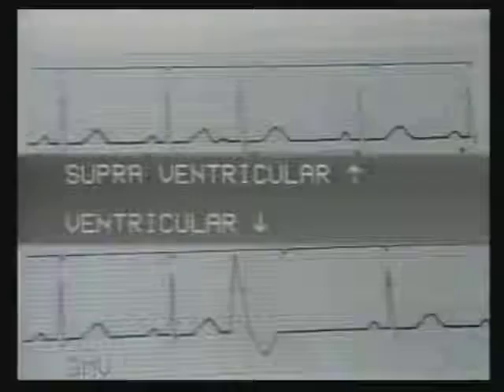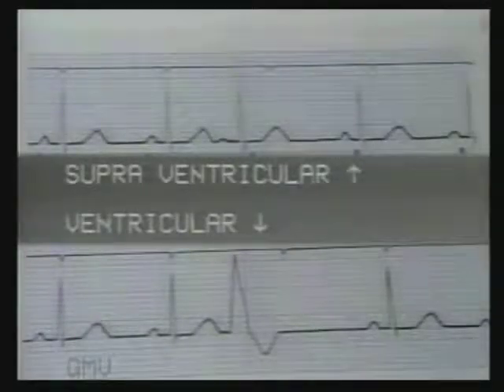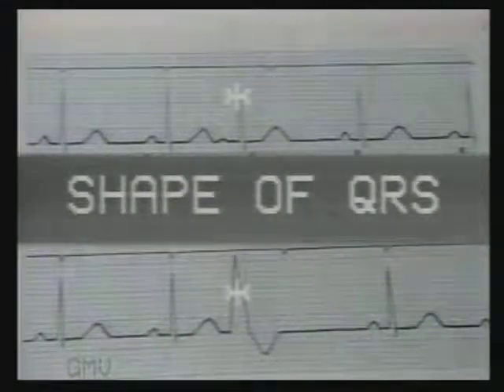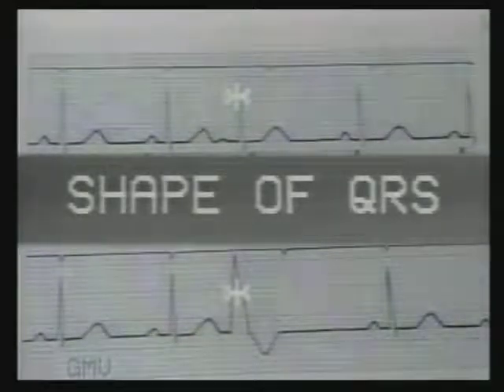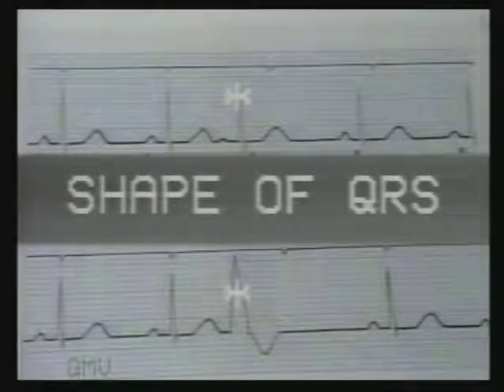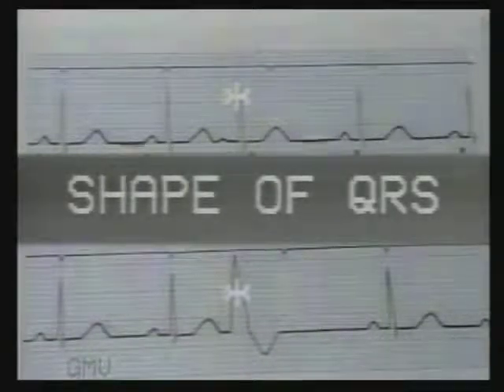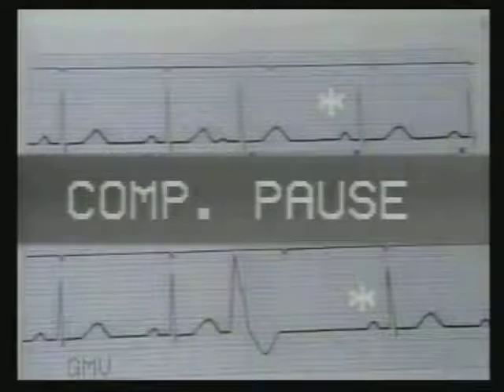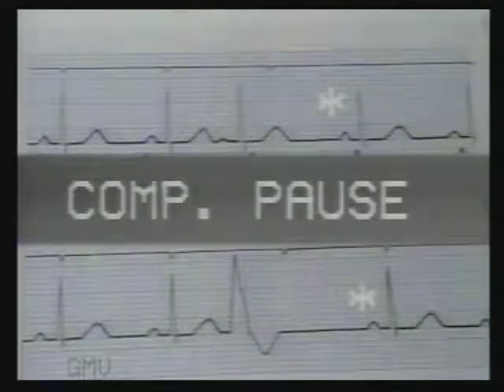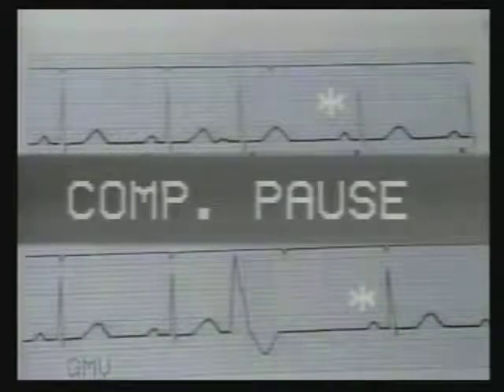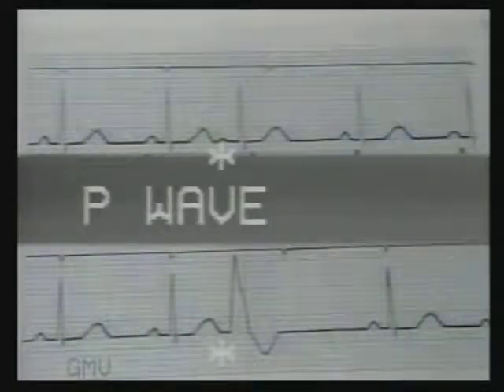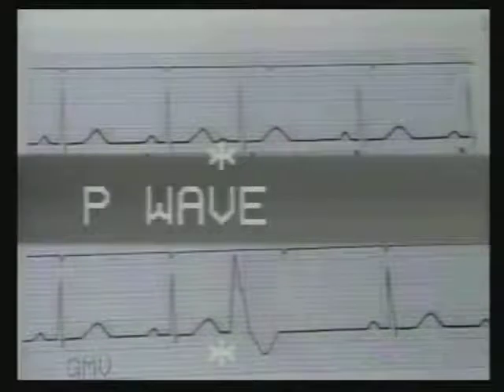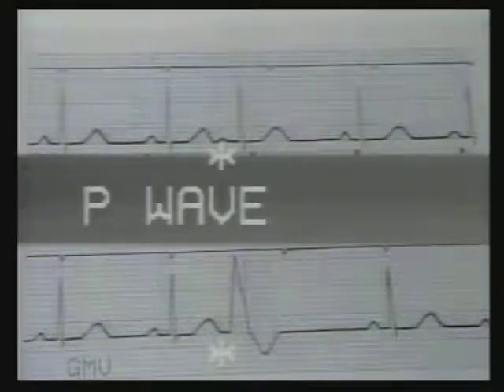Let us now study the differences between ventricular and supraventricular or atrial premature beats. Number one: the atrial premature beat has normal QRS configuration, while ventricular premature beats have a wide and bizarre QRS complex. Number two: the atrial premature beats have an incomplete compensatory pause, whereas ventricular premature beats have a complete compensatory pause. Number three: ventricular premature beats have no P-wave. A preceding P-wave is seen only in supraventricular premature beats, though it may not always be visible — it may be merged with the previous T-wave.